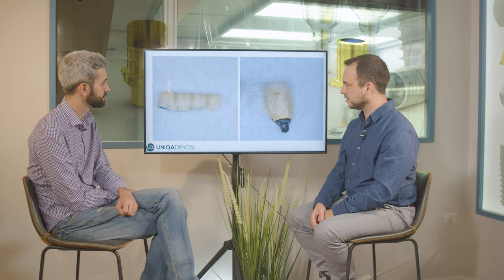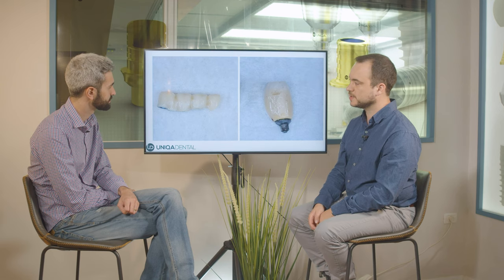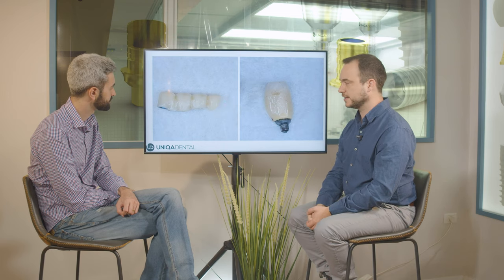Here you can see one of the crowns — the premolar — that broke when we took out the bridge. And you can see the zirconia bridge with the tooth that we've added. This cantilever comes in place of the tooth that the patient lost. You can scan the old bridge and have the bridge with exactly the same morphology — you don't need to change anything.